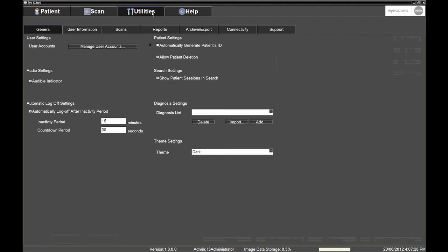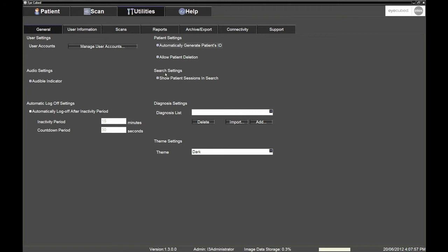In the General sub-tab, the Automatically Generate Patients ID field is activated by default. However, you may deselect this option if the user's preference is to manually enter an ID for patients. This will most certainly be the case if the centre or clinic is already attributing specific IDs to patients. Still in the General sub-tab, we recommend deselecting the Show Patient Sessions in Search option, as this will help simplify the patient deletion process.